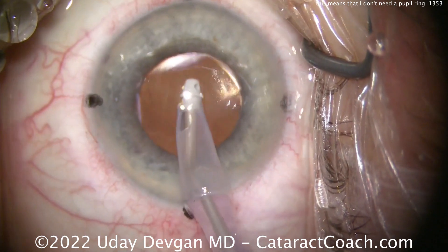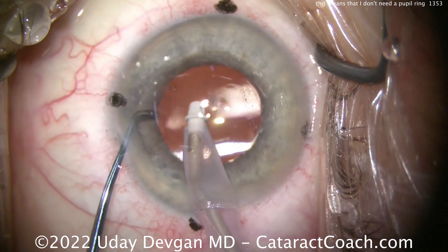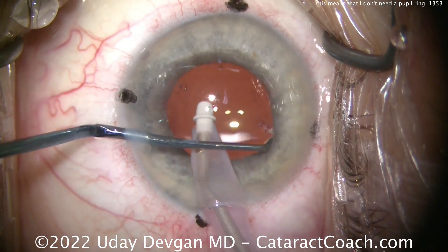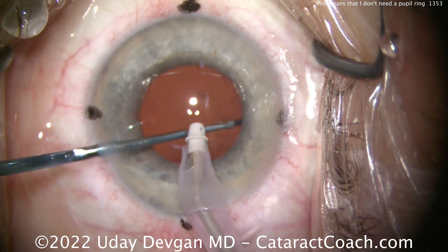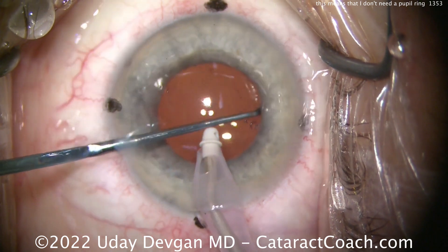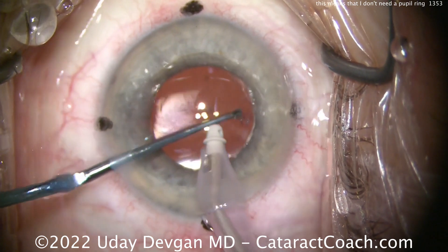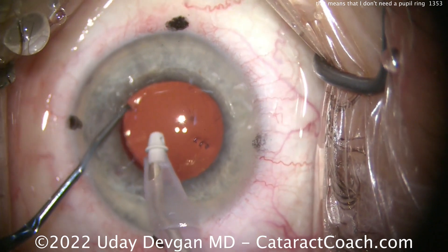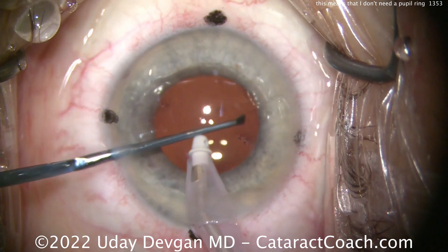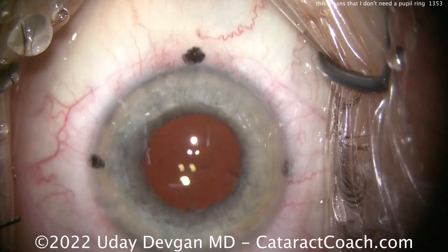As the viscoelastic comes out of the eye, we can see that looks like a nicely positioned lens. We can use our chopper to lift up the iris and see if it's in good position, or nudge it over a little bit more. The IA probe in the right hand is giving us the infusion to keep the eye inflated. That all looks really good — pretty happy with the outcome. Once we finally get it in the exact position, we can seal up and finish the case.